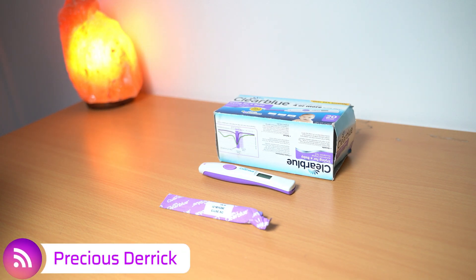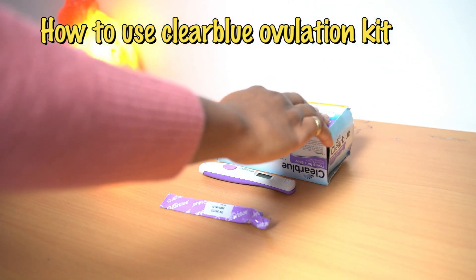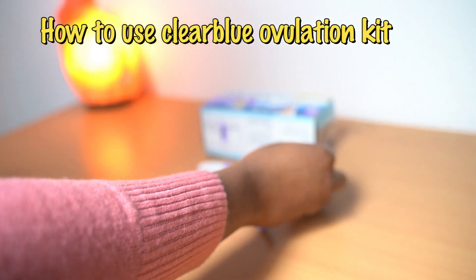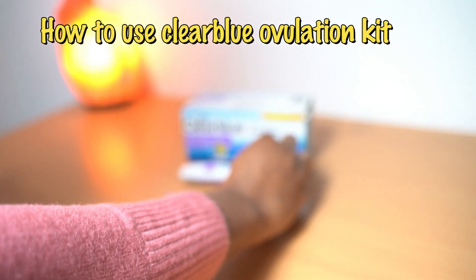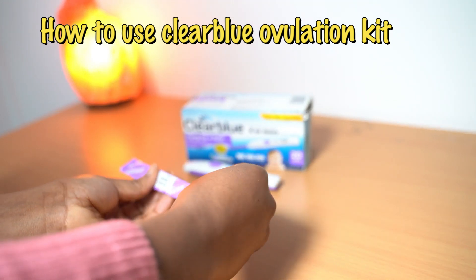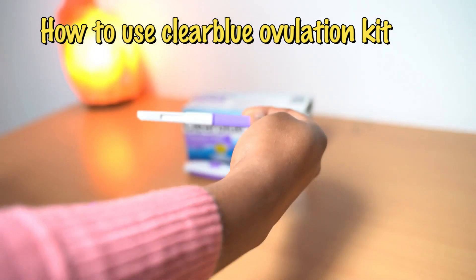Hi guys, today's video I'm going to be showing you how to use the Clearblue ovulation kit. It's going to be a demonstration and I'm also going to be doing a live ovulation test using my urine. I'm going to be explaining everything to you step by step, so sit back and watch this video to the end to clear every confusion you have about using this kit.